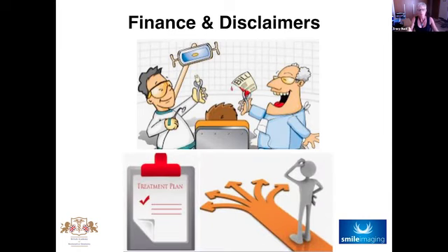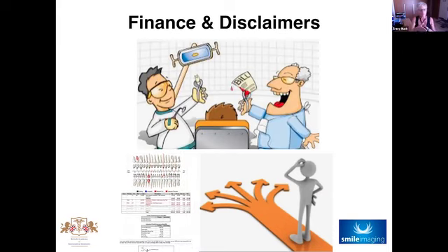When we used to present treatment plans, patients were often left scratching their heads. And the reason for that is because we presented the treatment plan in this way. If we look at this treatment plan, the only people that really understand it are us, because we see them every day and we understand there's going to be a root filling or a crown here. But the patient can't visualize how that's going to look in the mouth, the new crowns.